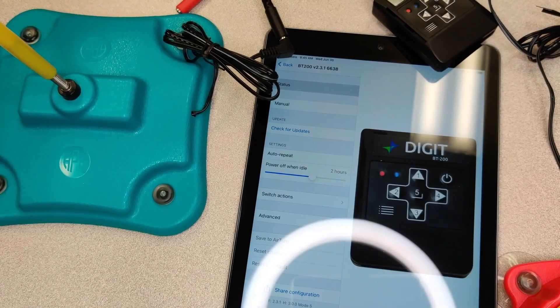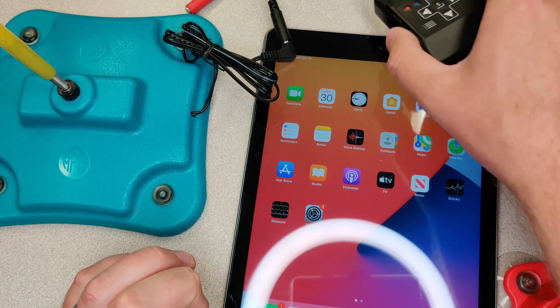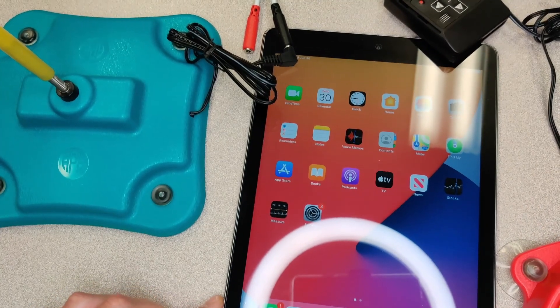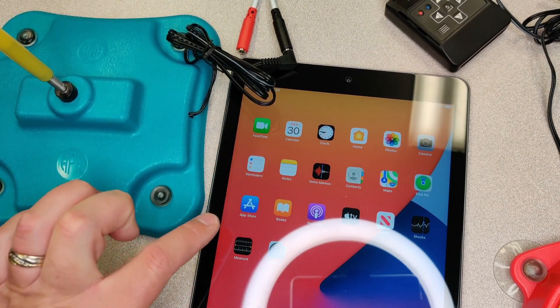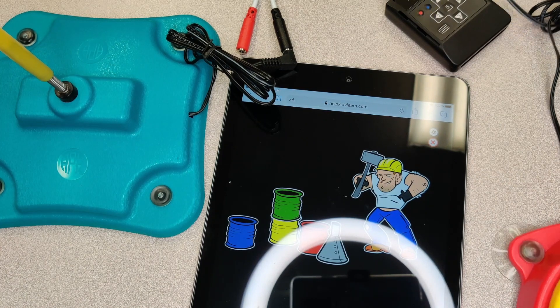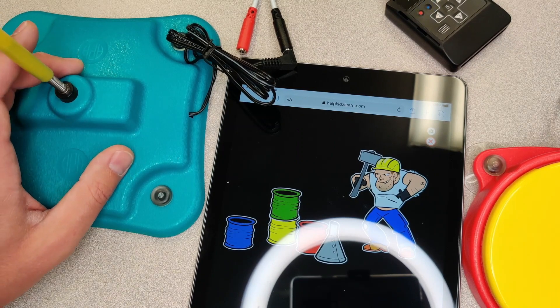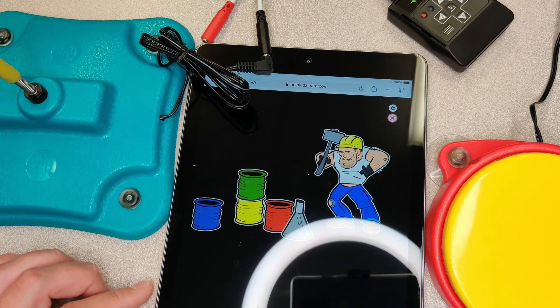We're going to open up our browser. The Digit is connected. We have our iPad and we're going to open up our software. We open Safari and go to helpkidslearn.com. If you have an account, you can sign in. Here's one of the games they have — this is more of a building one. It's more complex than a lot of them, but I wanted to show how easy it is for the two buttons to work together.